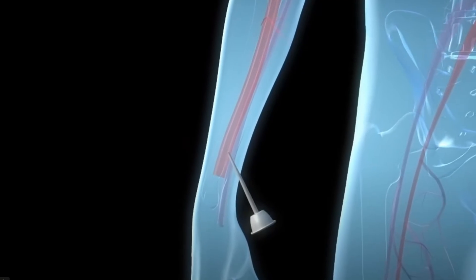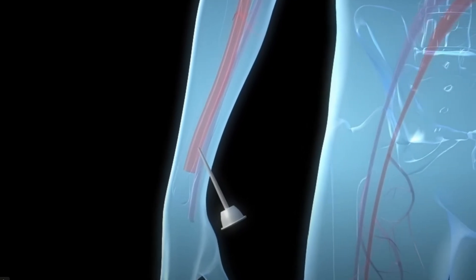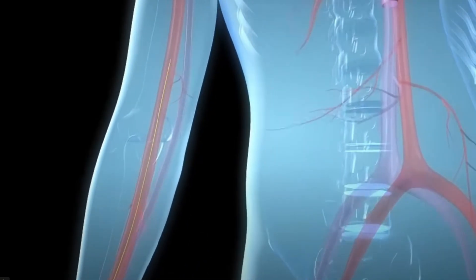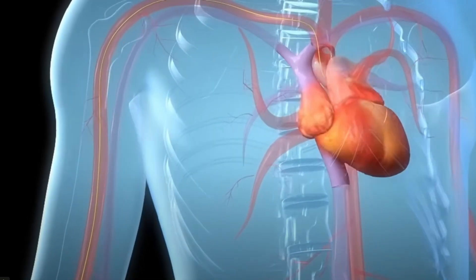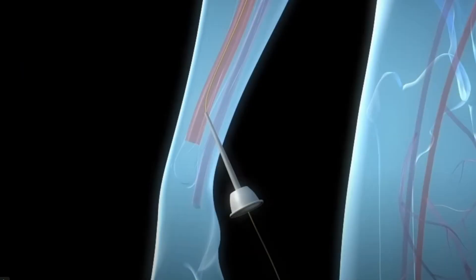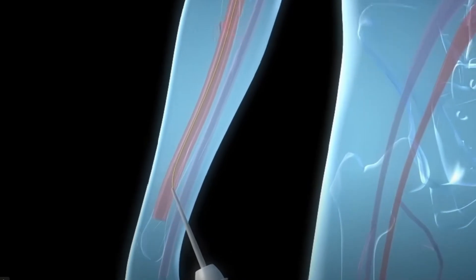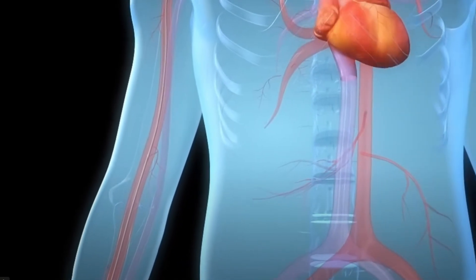A needle is inserted through the wrist into the radial artery. A guide wire is then passed through the needle and guided through the arterial system up to the heart. A flexible catheter is slipped over the wire and threaded up to the heart.